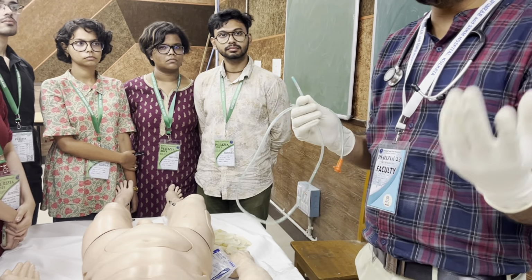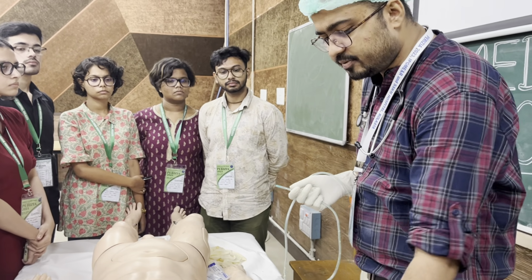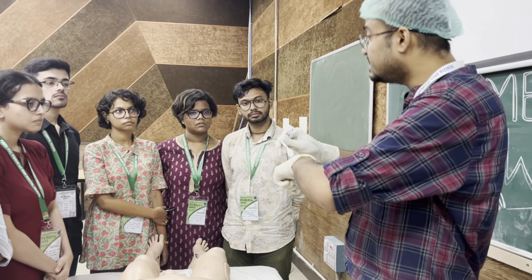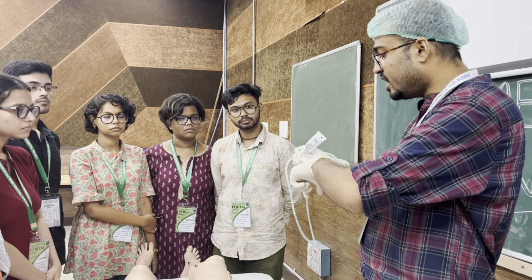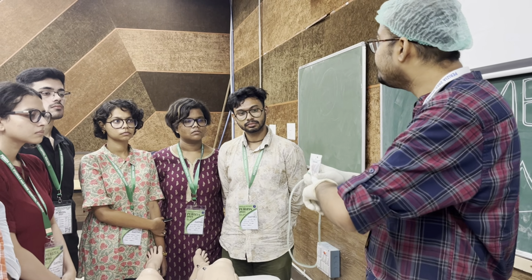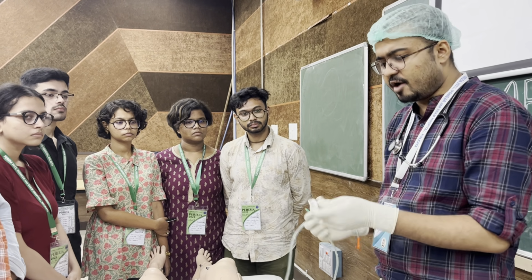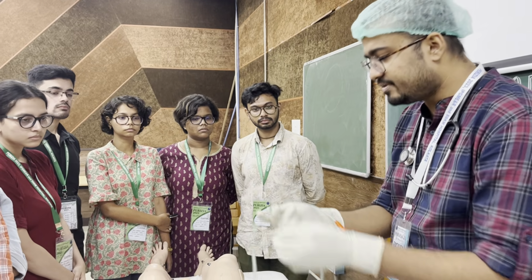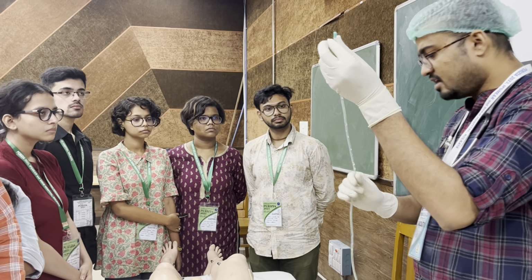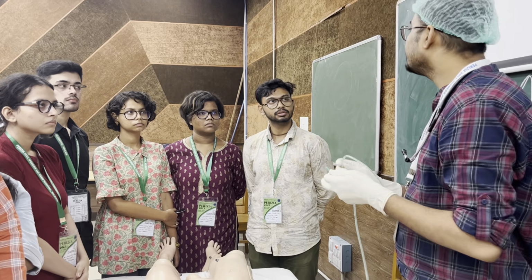Someone who is assisting me will be giving some amount of this gel. This is local anesthetic gel, because I want to make this procedure less painful. Otherwise it will be very painful. So you have to take some amount of gel. I have taken some gel and applied it over the tube, up to the length which you are going to insert.